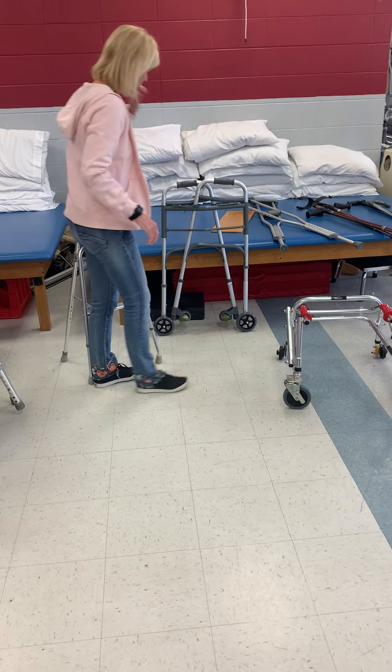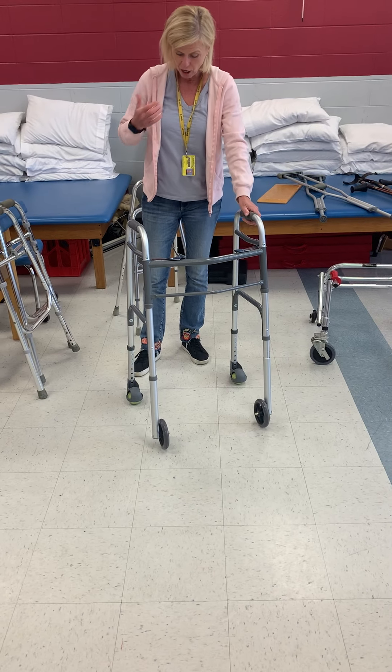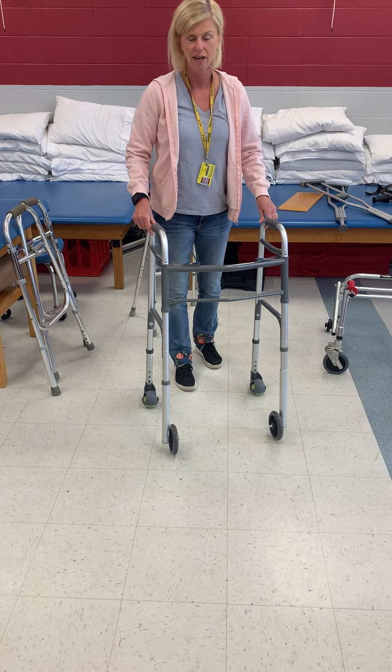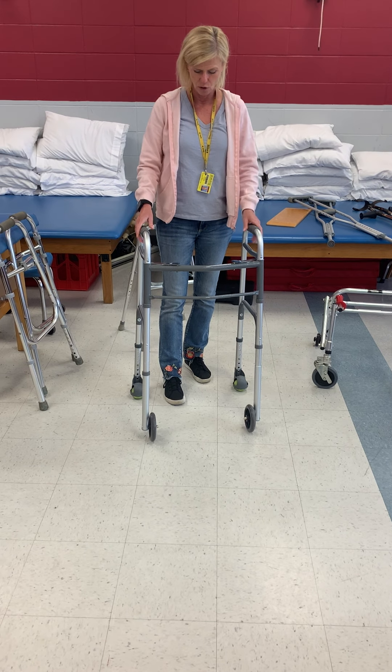This is a two-wheeled rolling walker. This one has tennis balls on it. You can also get ones that have a little slide on the back, so that if somebody has carpeting at home, it's not making indents in the carpet. Plus they can be kind of noisy.